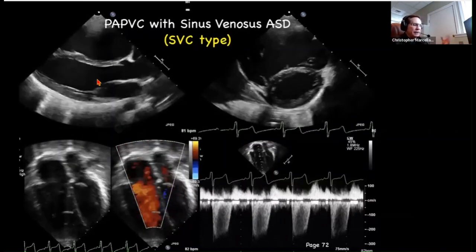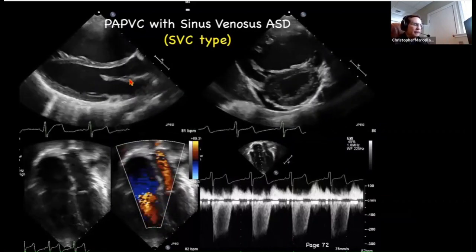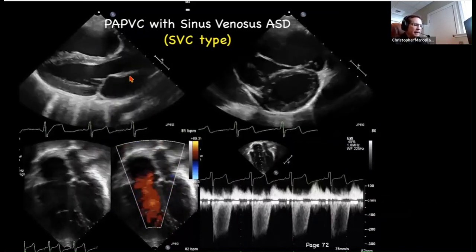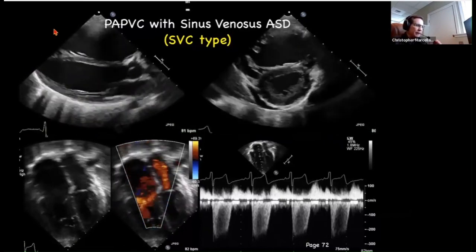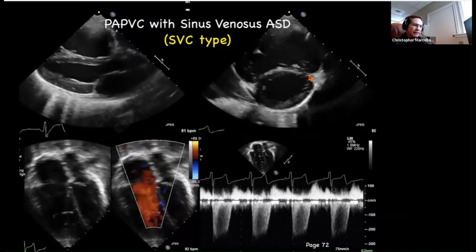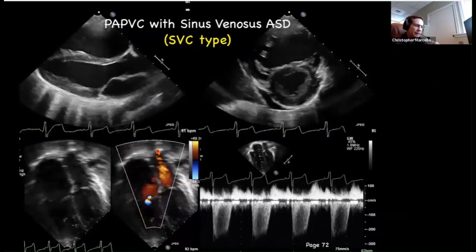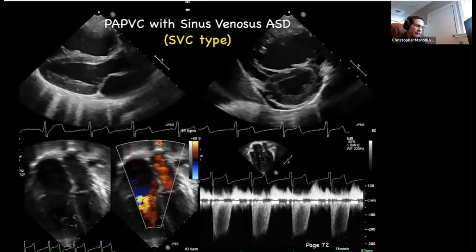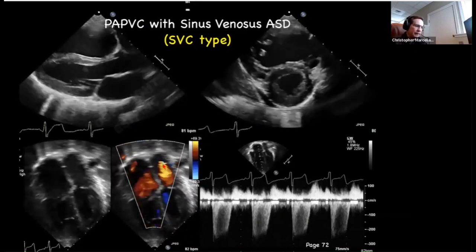At this time we were just scanning parasternally first. So put the probe on, and first thing I think of, it's probably an ASD, because you get this sort of elongation of the LV in a big right heart. There's diastolic flattening. It's not systolic flattening, but the right heart's pretty big. In the 4-chamber view, yeah, the right heart looks big, but you see flow coming in from the pulmonary vein, so it looks relatively like there's not much going on.